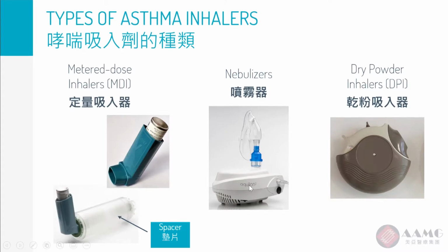With the COVID-19 coronavirus pandemic for the past few months, we have stopped using this type of nebulizer if possible in the clinic setting and also in the hospital setting, unless you're in a special room. The reasoning behind that is that if you are a carrier of the COVID-19 virus, or if you are infected, that's why you have the asthma attack in the first place. And if you use this machine, you can potentially aerosolize the virus and infect other people in the clinic or in the hospital. So if the patient has to use it at home, for the past couple of months, I have advised the patient to use this in a room with the door closed, and nobody should enter the room for about 2 hours after the nebulizer, in order to prevent spread of the virus to family members.